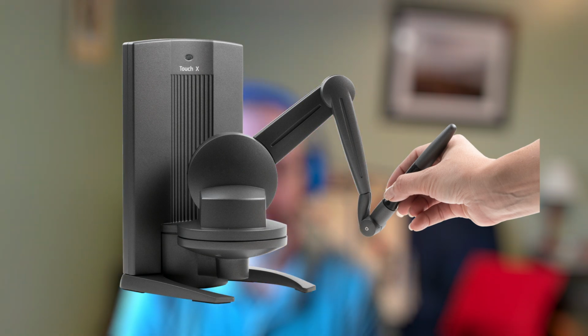The Freeform software is a voxel-based modeling software that was specifically designed to use with a haptic device, and it allows users to offer a level of creativity and development that is not achievable with any other CAD software. The voxels react in real time, so when you push into a model, the voxels update as soon as you push or pull onto that object in the virtual space. And it's the supreme software, in my personal opinion, for modeling with organic shapes, specifically human anatomy, or even organic anatomy, like figurines and toys of that nature.